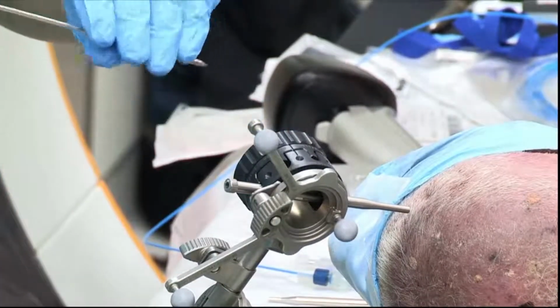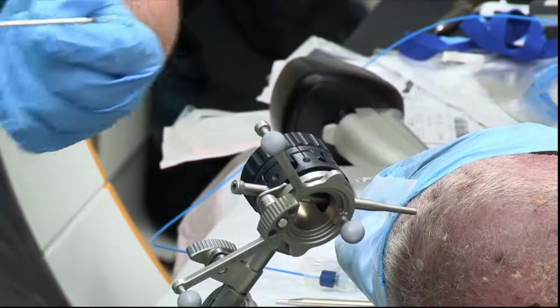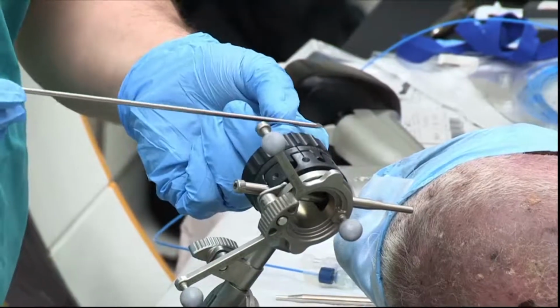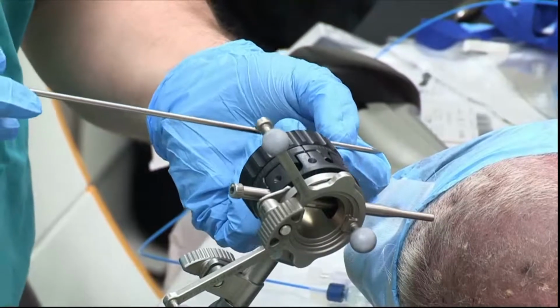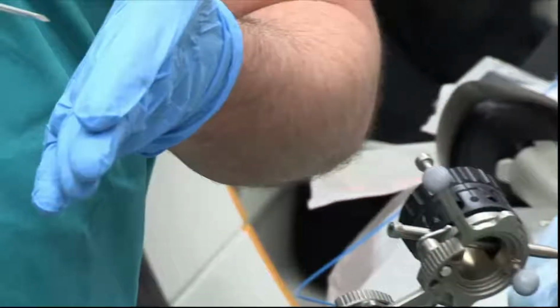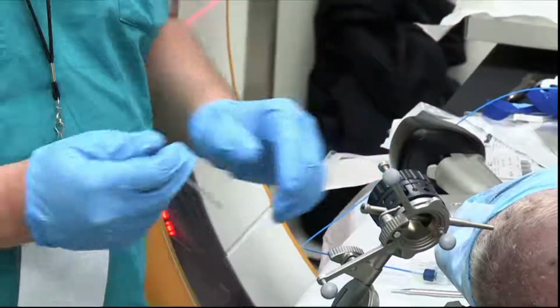Obviously, if you're doing this and anywhere there's thin bone, especially pediatric patients, you want to be very careful. And this is all, you don't see anything. This is all tactile feedback. So you want to go down and you want to make a little divot in the skull. What we found is if you're not paying attention or you neglect this in any way, you can kind of walk down a little, or if this is the skull, then it kind of slides. And so we really got to pay attention. You can put some pressure inferiorly to make sure that it stays along its intended trajectory. And we'll start with that.